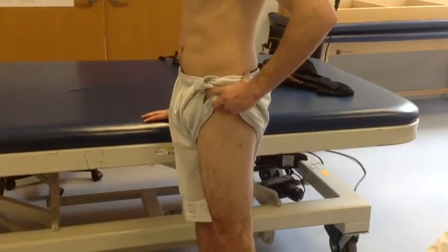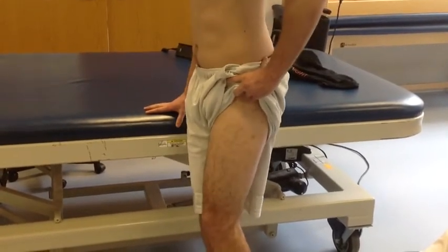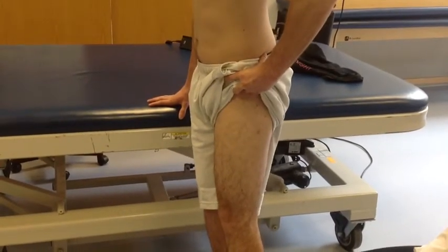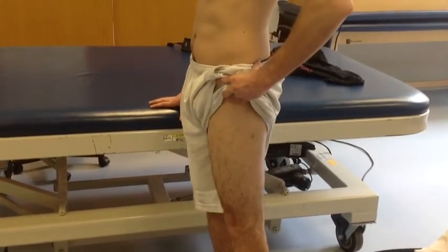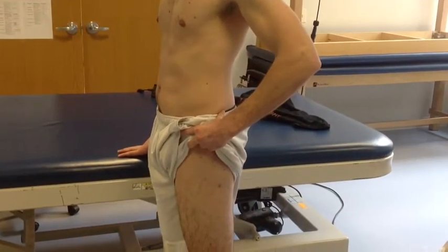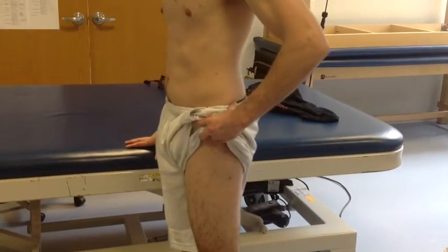In order to test active hip flexion, the patient must first start in a standing position parallel to the table for support, with the upper leg exposed. The patient should have a neutral spine. Asking the patient to stand up straight, keep the shoulders back, or imagine a string pulling them from the top of their head may be helpful cues.